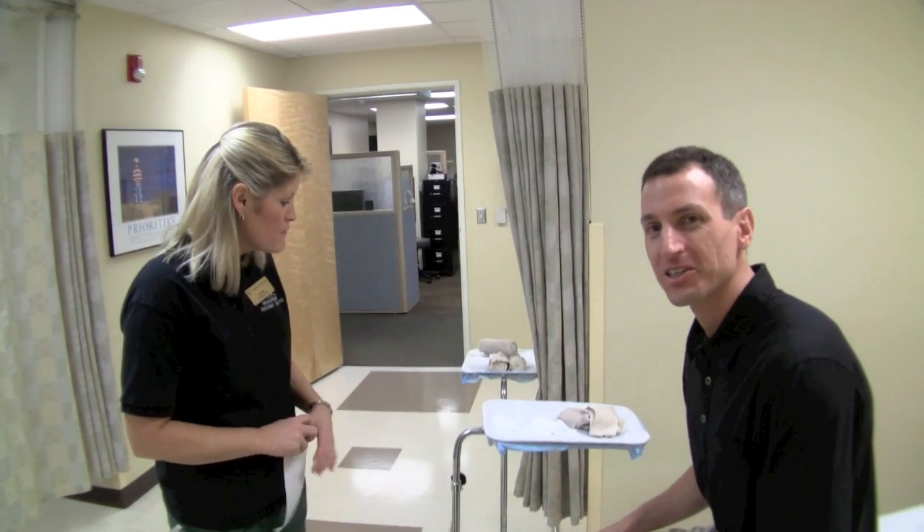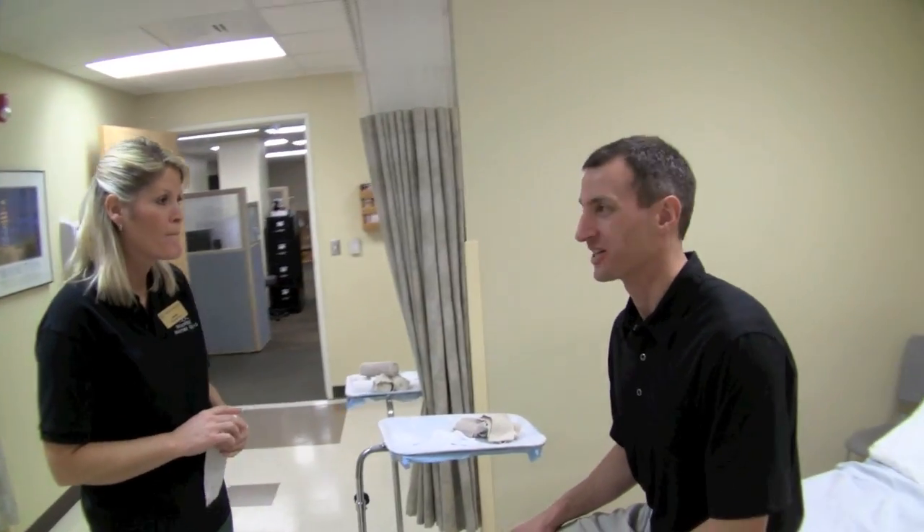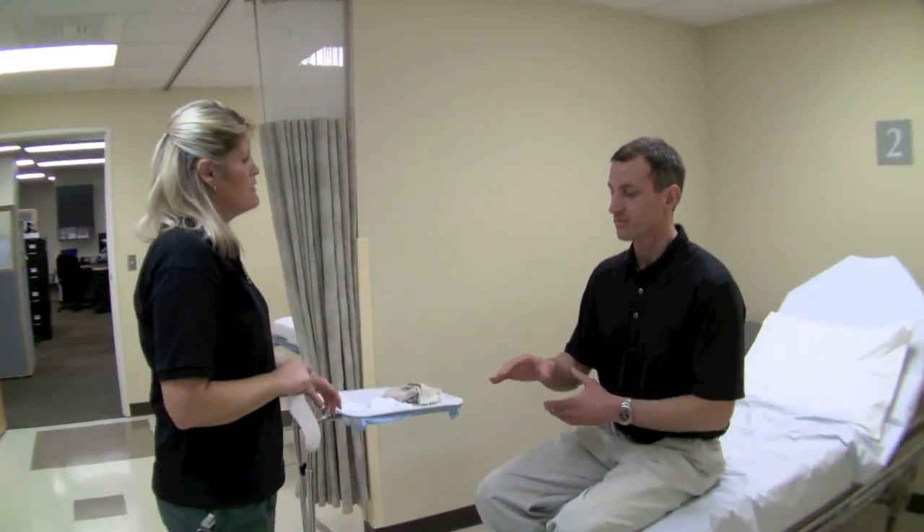Now we're going to do the ulnar gutter splint, perhaps for a Boxer's fracture — if you believe in splinting Boxer's fractures or fractures of the fifth metacarpal or other fractures as well.